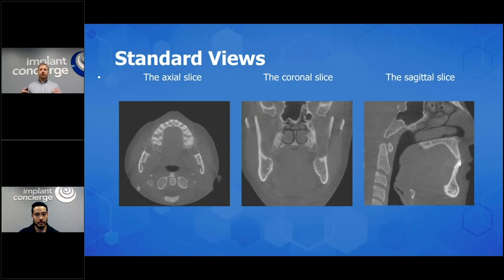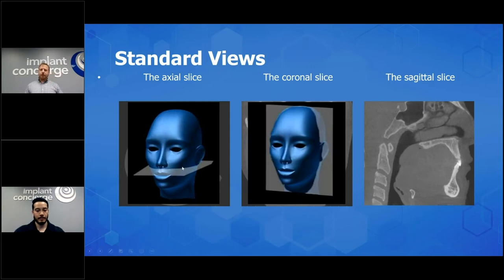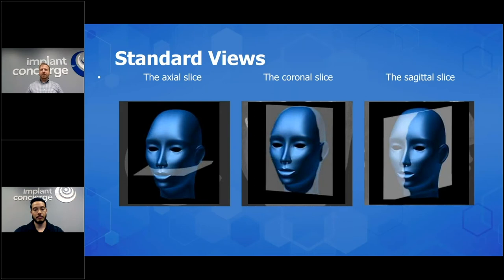To get everybody on the same page — some people might have a lot of knowledge on cone beam CT, others might not. But you have the three main views, plus a few others like your reconstructed panoramic and your 3D views. Your axial is going to be parallel to the floor. Coronal is going to be parallel to the front of the patient's face — great for looking at the nasal cavity, the maxillary and paranasal sinuses. The final one being sagittal, going from left to right, and the center line of course is what's called your mid-sagittal line.